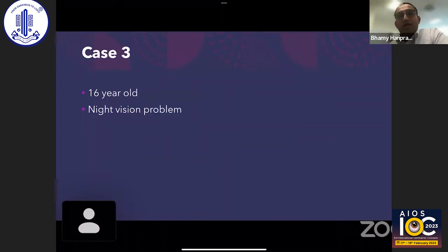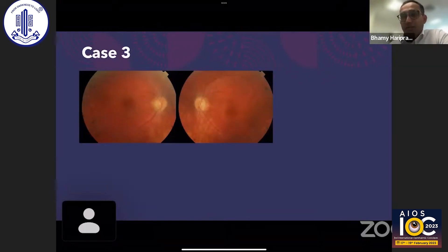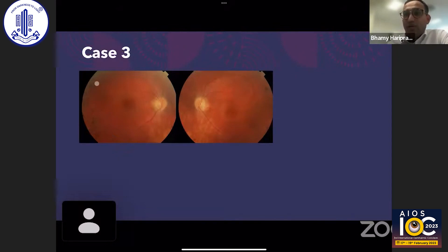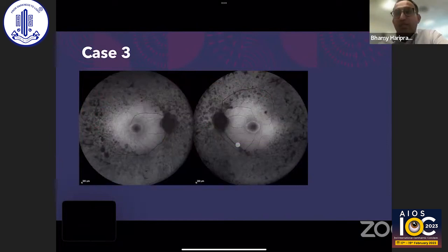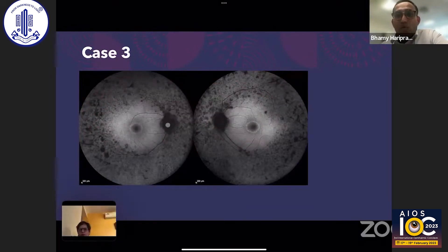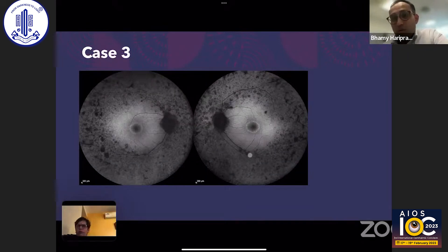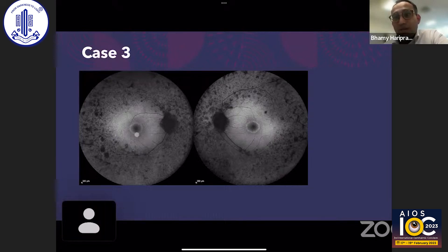Case 3 is a 16-year-old girl referred with problems with night vision. The fundus picture shows typical retinitis pigmentosa features — bony spicules, waxy pallor, attenuated blood vessels — appearing as early RP. However, fundus autofluorescence reveals this is actually very advanced retinitis pigmentosa, with far more extensive changes visible than on the classical fundus examination.